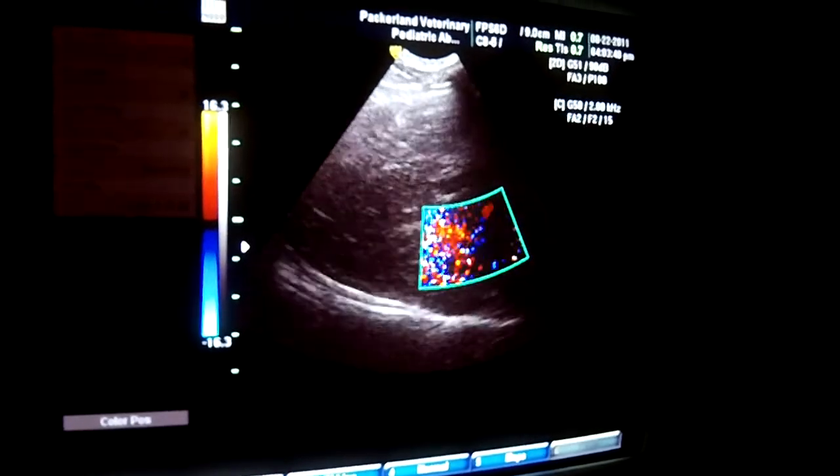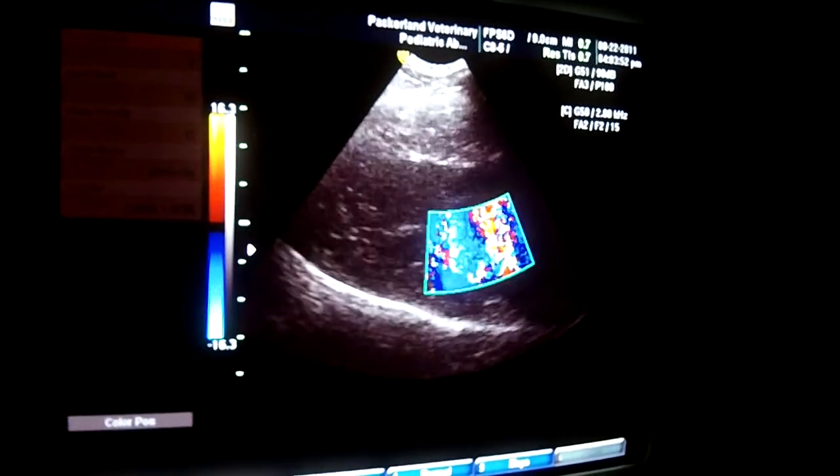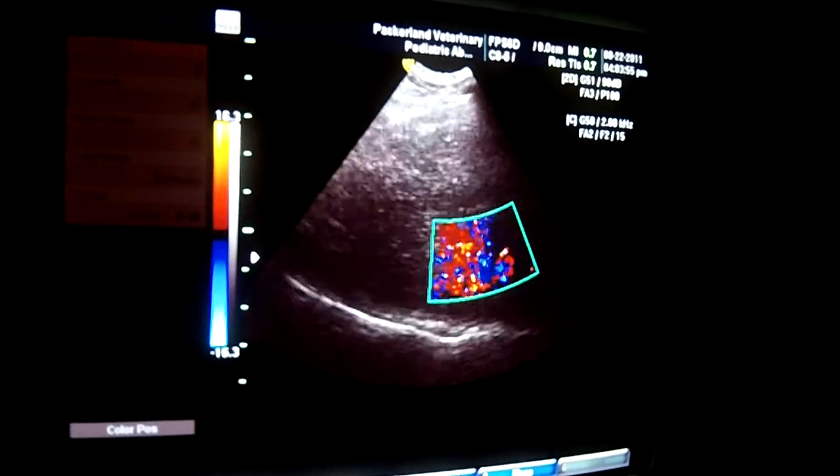So every time the heart contracts, we get a backflow of blood back into the left atrium, which is not supposed to happen.